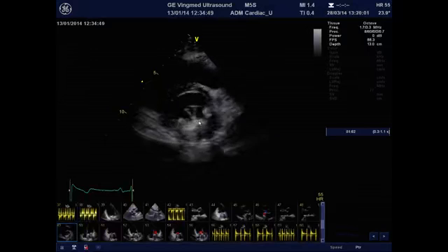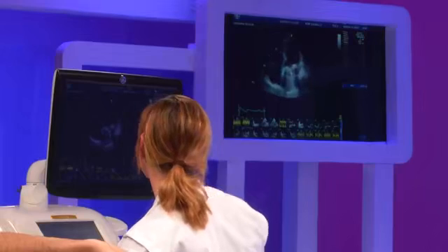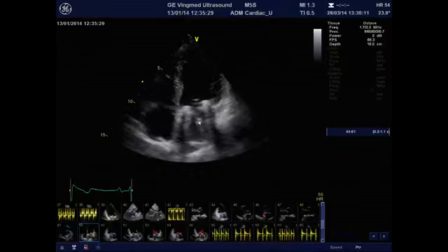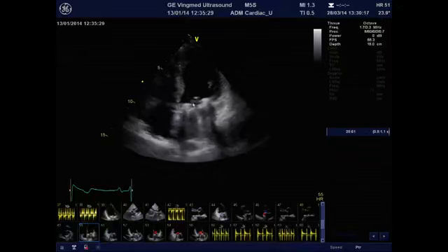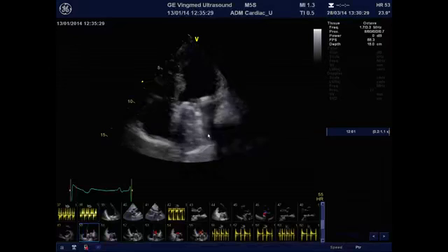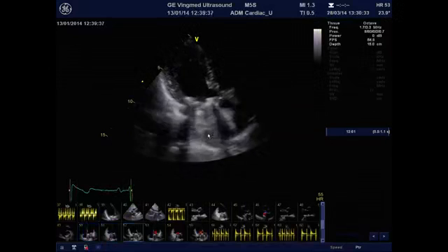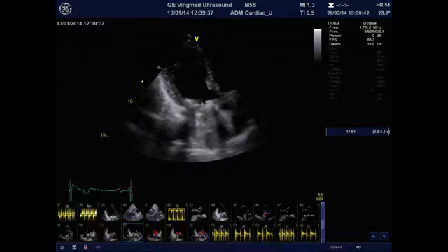After this, we're going to continue the evaluation of the mitral leaflet mobility in the apical views. Okay, so here you can see the normal movement of the leaflet, and you can appreciate also the reverberation and the shadowing in the left atria. So we're going to do the same thing in 4-chamber view, in 2-chamber view, and also in 3-chamber view. You can see that in each view, we perfectly see the movement of the leaflet that are strictly normal in that case.